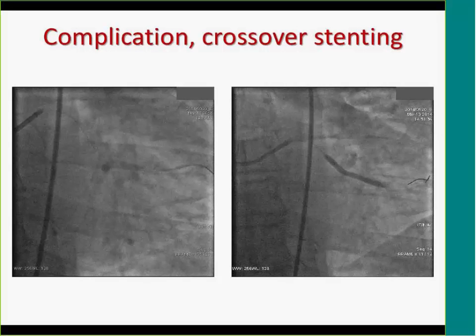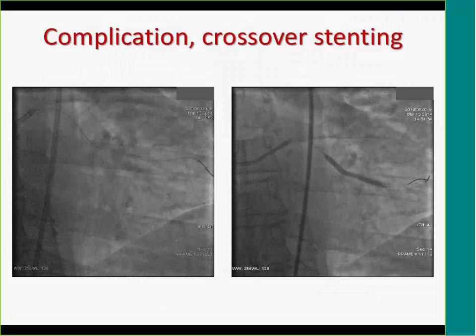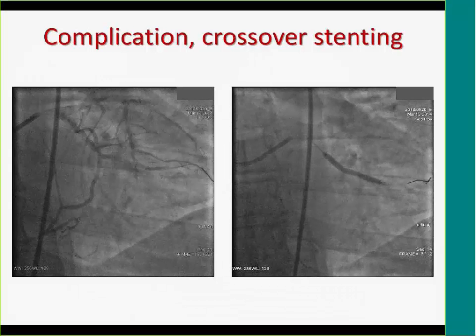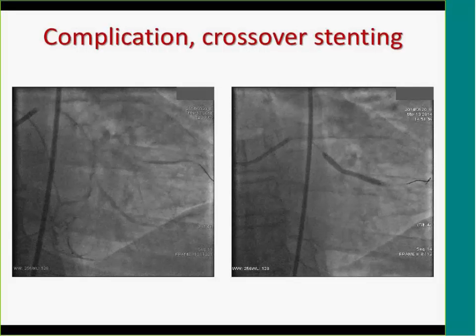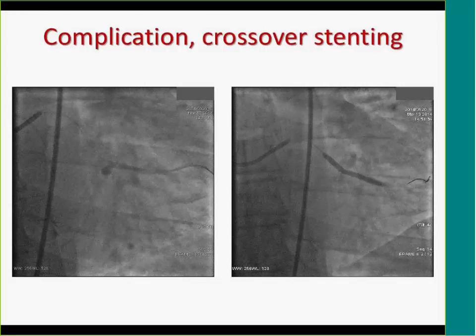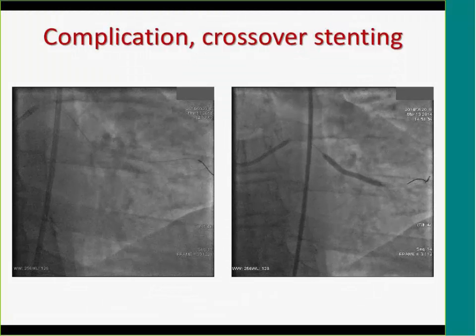No, absolutely. I mean, the patient is unstable. The priority is to make sure the patient gets stabilized more than anything else. So I completely agree with you. Yeah. Actually, the other option would have been emergency surgery, but the patient was a very poor surgical candidate, so we decided to stent this marginal.